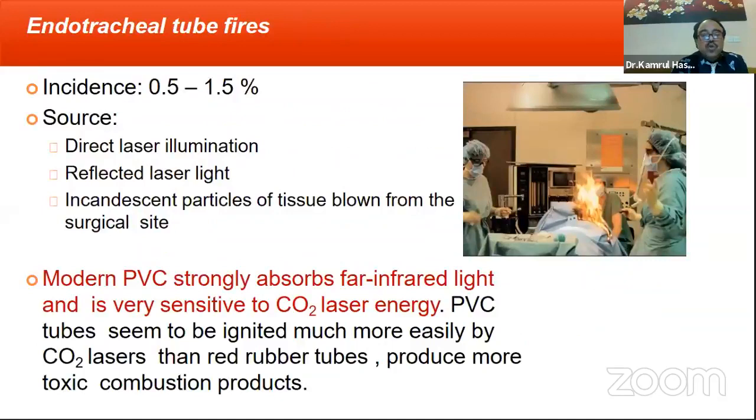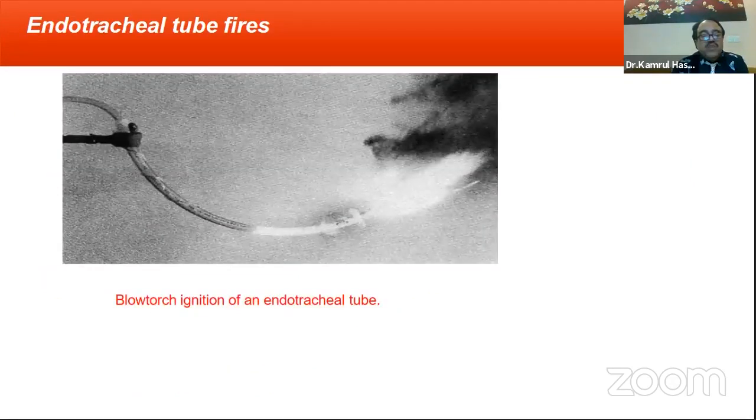Endotracheal tube fire, we have had an experience. We immediately stopped the oxygenation and immediately stopped the fire. Fortunately, the patient was all right, with no problem. Worldwide, it is 0.5 to 1.5%. So a proper anesthetic tube and proper machine should be used. The cuff should be inflated with water, not with air. The face and other areas should be covered by wet gauze, otherwise if there is a chance of ignition, it will be dangerous.